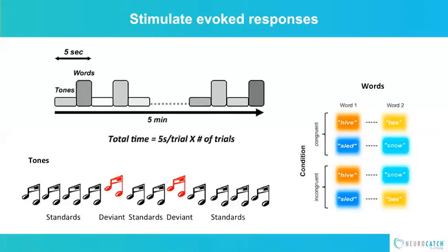So we're going to talk about an auditory sensory response just to processing the loudness of these tones called the N100. And then we're also going to talk about processing this deviant tone, this unexpected attention. So you have to use basic attention to say, okay, what was that? Which is this P300. And then for neurocatch, the N100 and the P300 come from the tones.